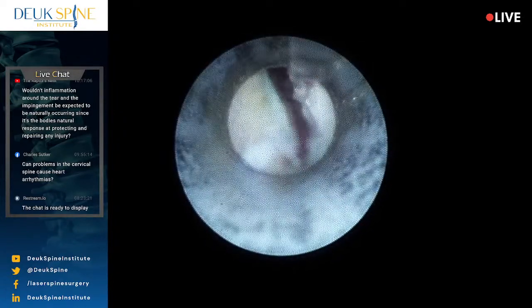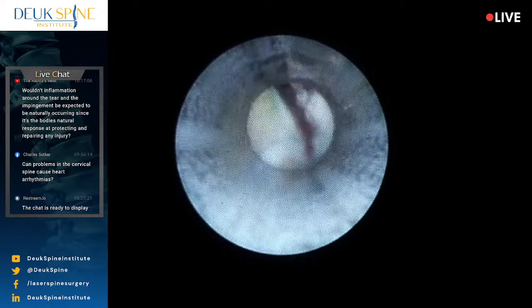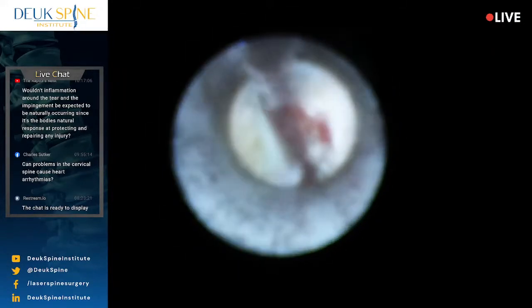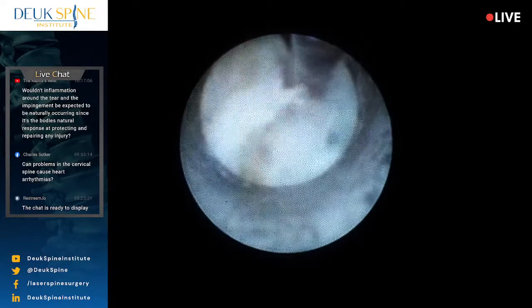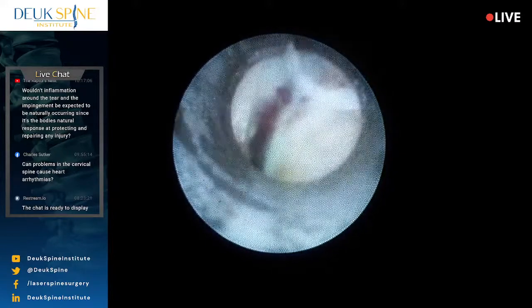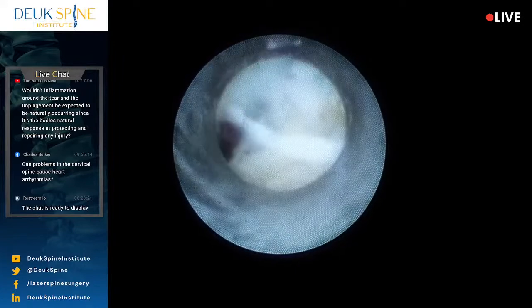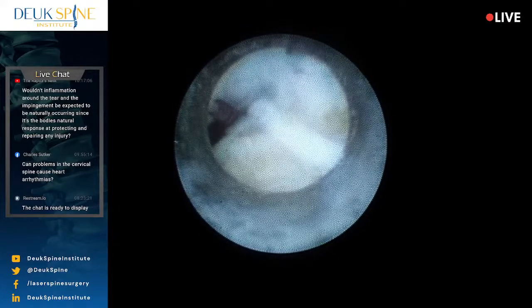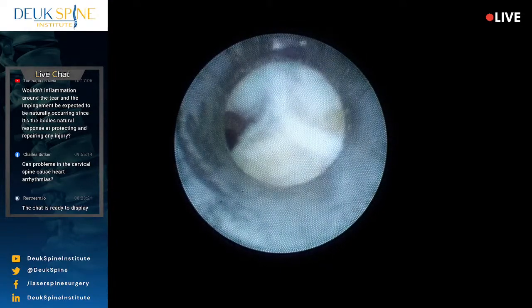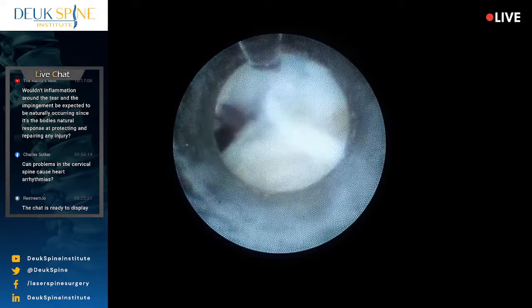Now what we're looking at down here, this crack or abyss, is actually the epidural space. The spinal cord is just down there. We wanna stay away from that, obviously. But I need to get rid of the herniation at the back of this disc on both sides. And the nice thing about cervical, can we move this IV pole just a little bit, please? It's right in my field of view. And you can see the laser fiber.